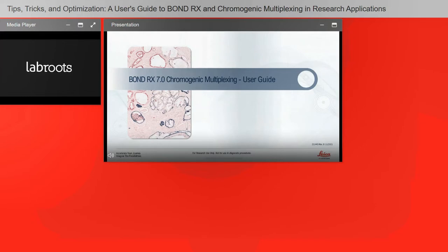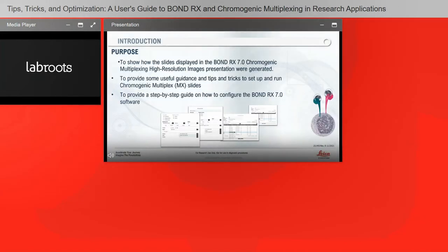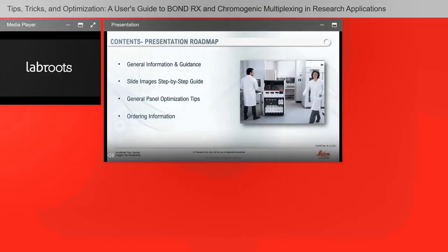Let's dive right into our user guide. The purpose here is to show you some multiplex IHC images, provide useful guidance on how to set up and run chromogenic multiplex slides, and also offer a step-by-step guide on how to configure the Bond RX version 7.0 software at the slide setup level. Here's a presentation roadmap for you.